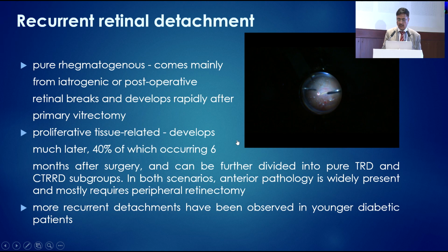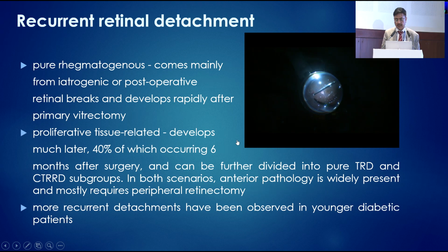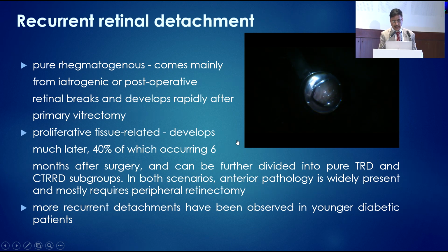As Praveen showed elegantly, sometimes you have to use air. After you have cleared the posterior hyaloid, the peripheral vitreous can be effectively cleared very well, as is shown in this case, under air.